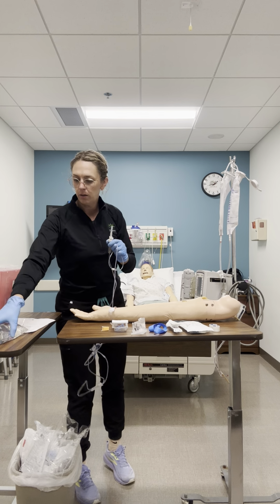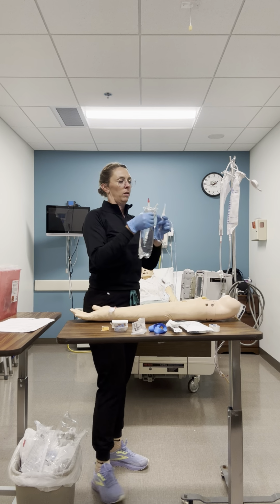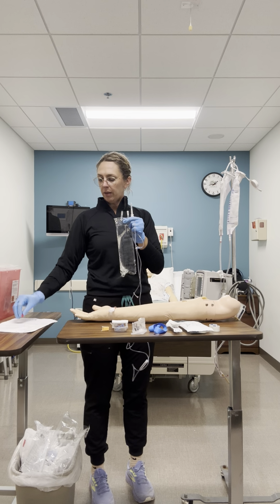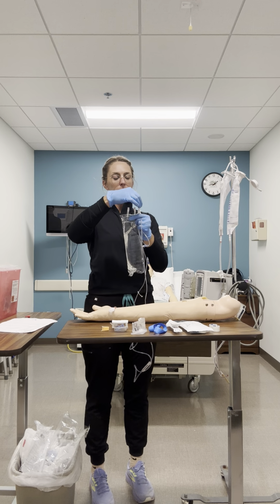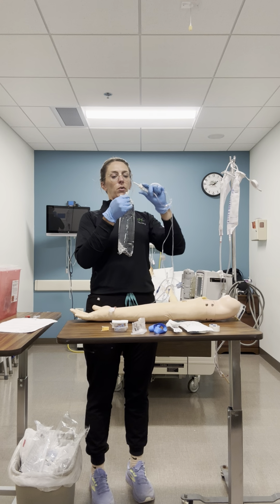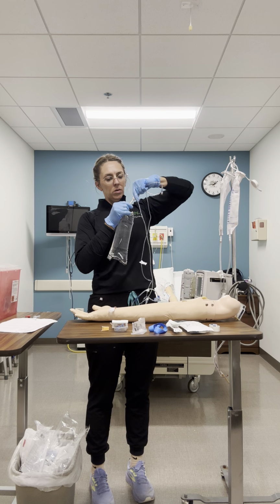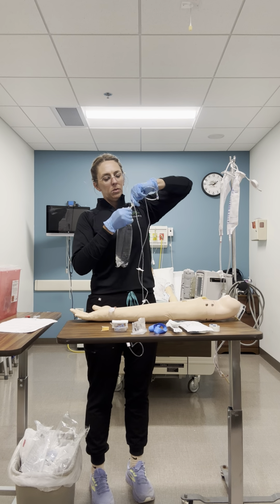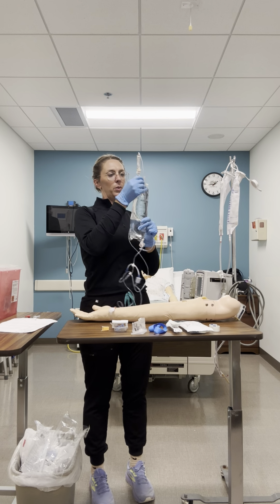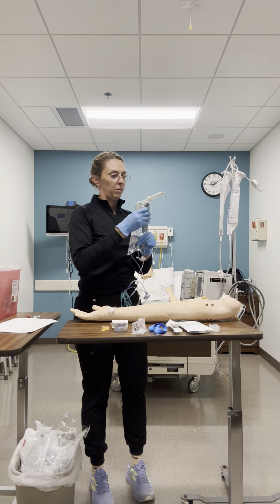Got my cap on. Got my bag. I'm going to flip my bag over. Carefully take my lid off. We're going to make sure that this stays aseptic. So lids stay on. They do not touch anything except for each other. Spike goes into my bag. My tubing stays up. I'm going to push some of the air out, and then I'm going to flip my bag.